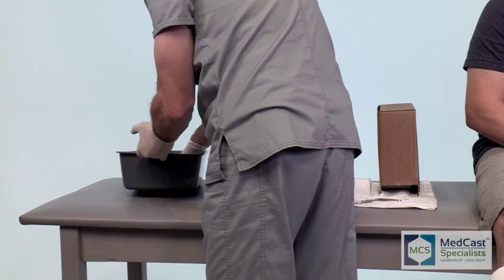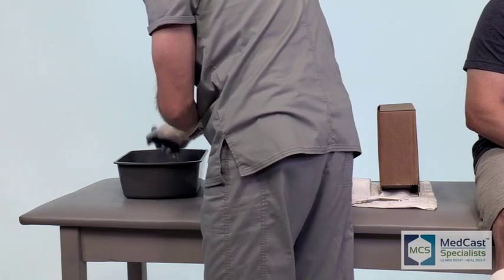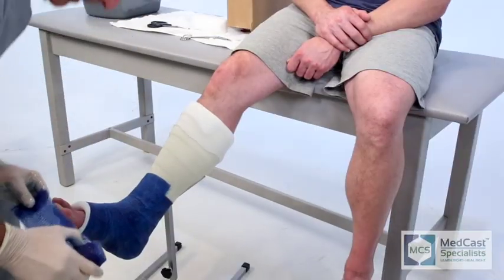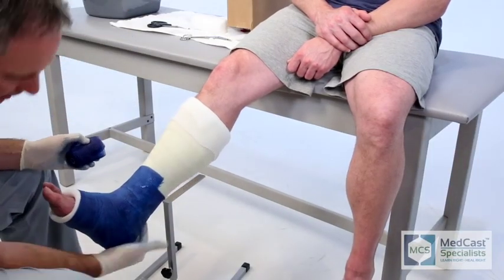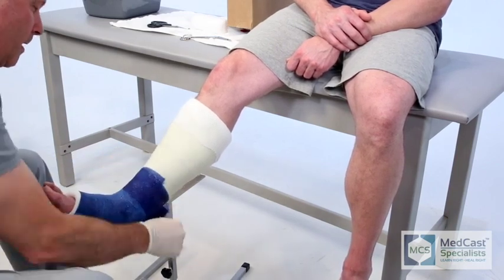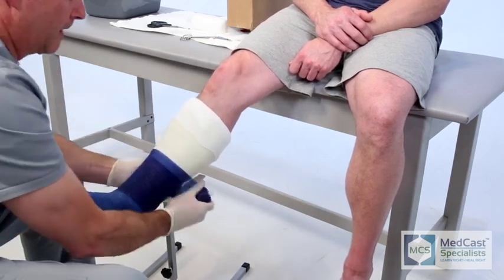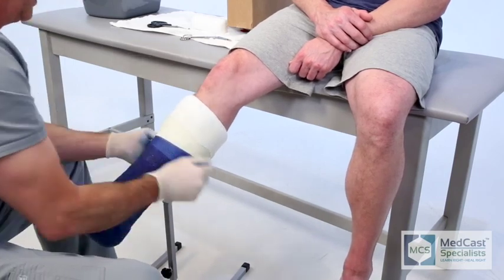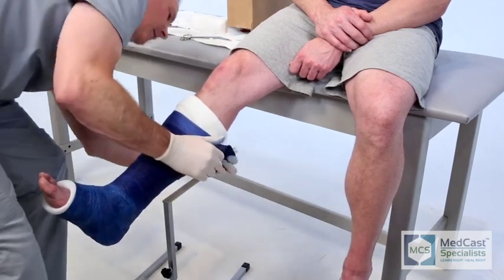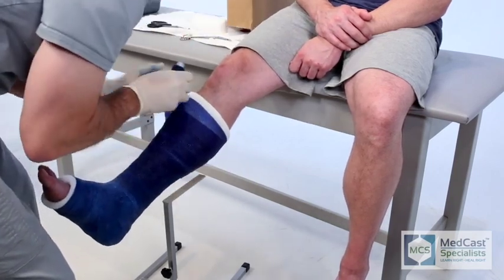On a short leg cast, if we do use a walking cast, we'll either apply an extra roll on the bottom of the foot to reinforce the bottom or we'll apply reinforcing strips to strengthen it — it just depends on how active that patient is going to be. If they're young and full of energy, you can almost guarantee they'll come back with a hole in that heel even if you put them in a protective cast sandal. Most adults typically do not wear the bottoms out, but if they rest it on the ground a lot, make sure that heel is very strong so it doesn't break through.